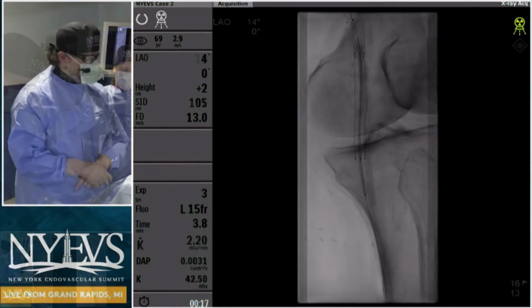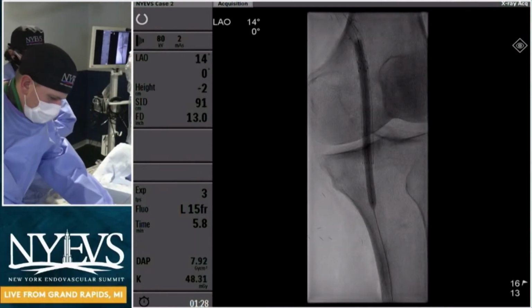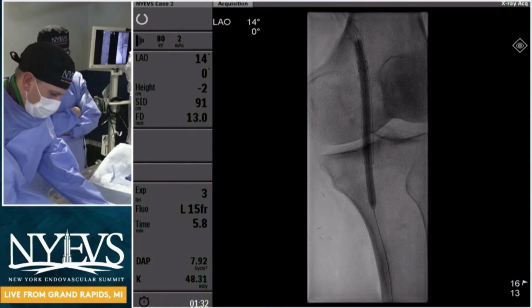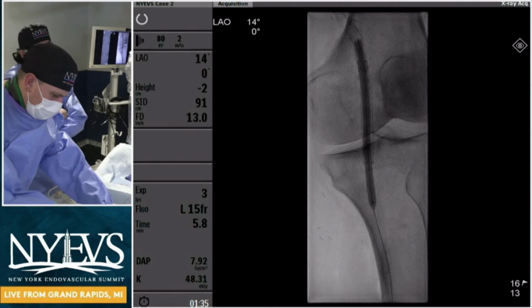Fadi, we've been watching you along on the side as Dr. Fisher gave his wonderful IVUS talk. So can you just go over what you've done, and then we can talk about what your choice was?